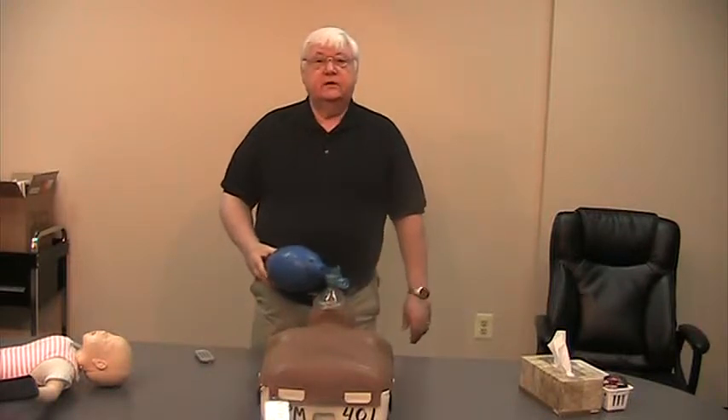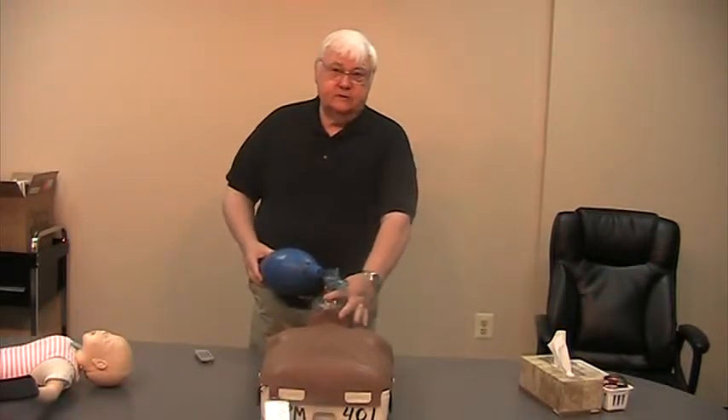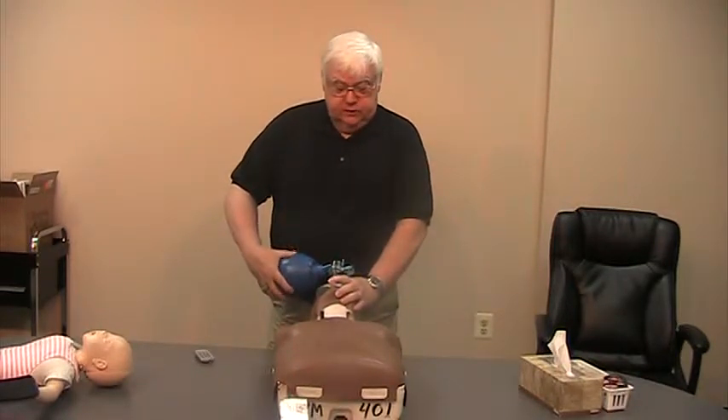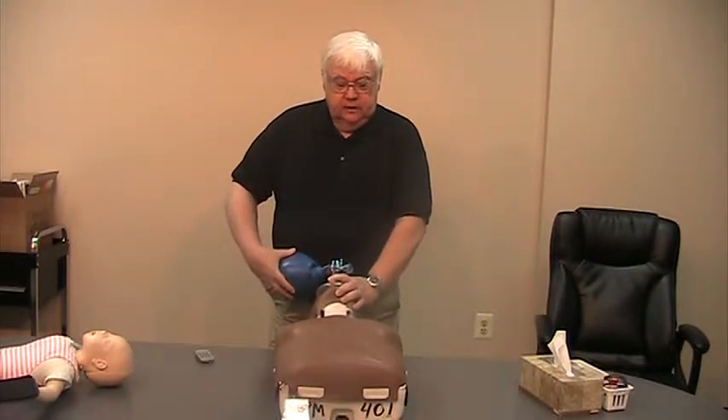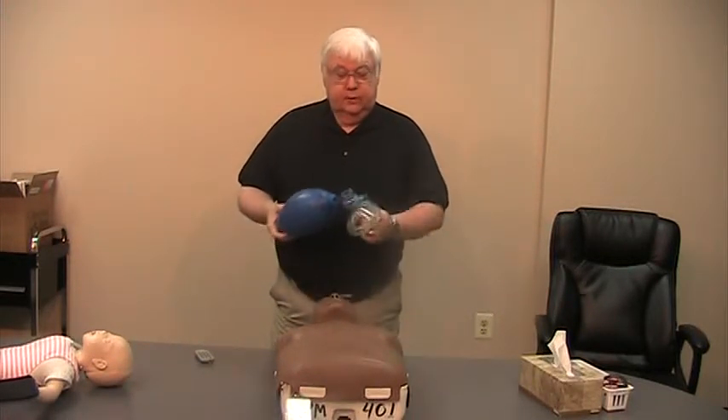Pointy side to the nose. The American Heart Association talks about the EC technique — this is the C, this is the E. Two fingers on the very tip top of the mask straight down, three fingers under the jaw, head back all the way. Two slow squeezes of the bag — one, two — watching the chest rise.